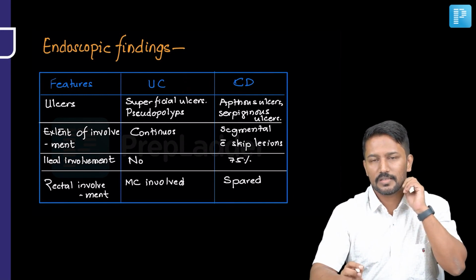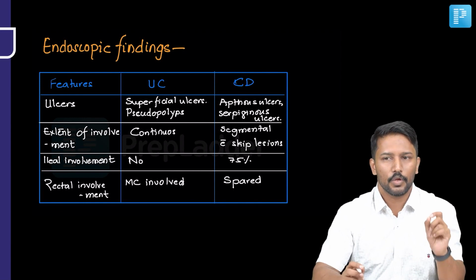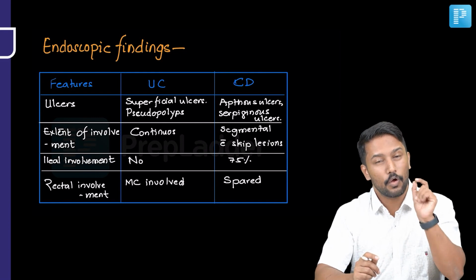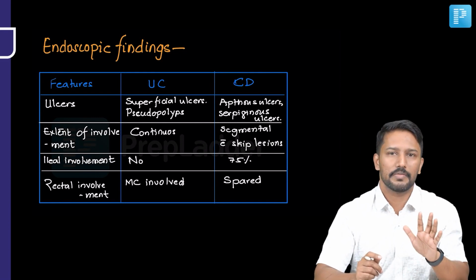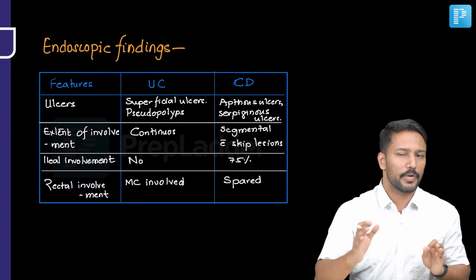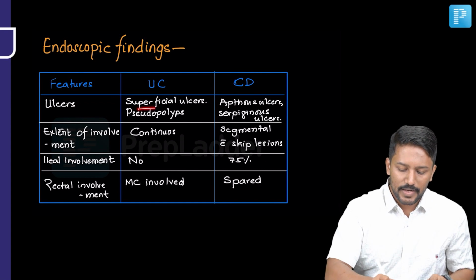What you initially see, when you actually look at the real images of normal patients on colonoscopy, is that the vasculature is visible through the mucosa. Then the loss of vascularity starts becoming evident. But as the disease progresses, what you will notice is the development of ulcers. Now, in ulcerative colitis, these ulcers are very superficial.